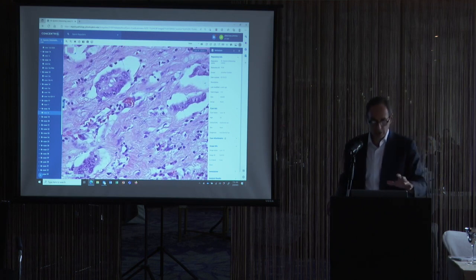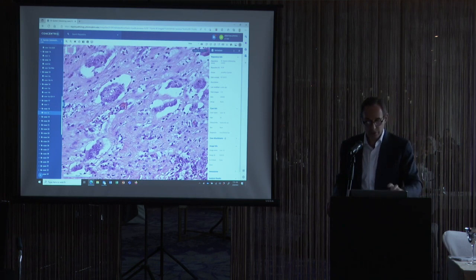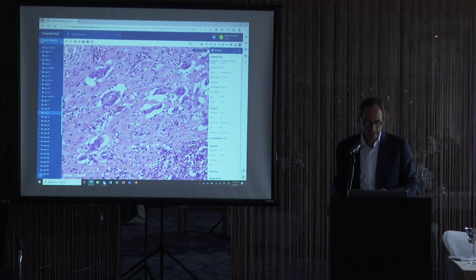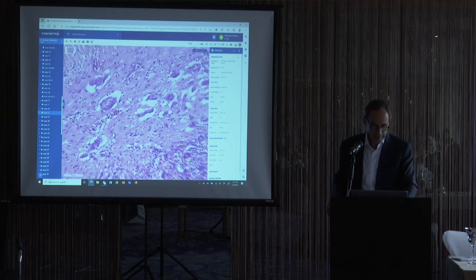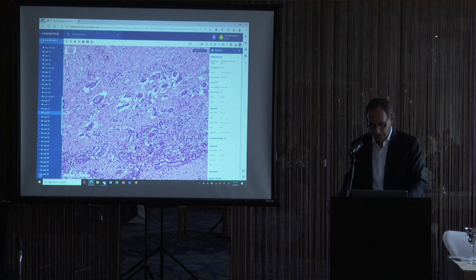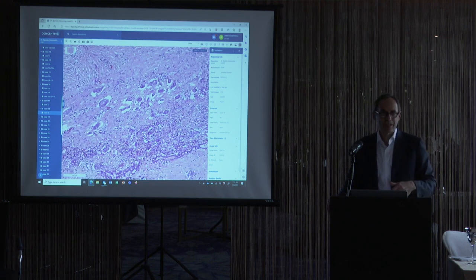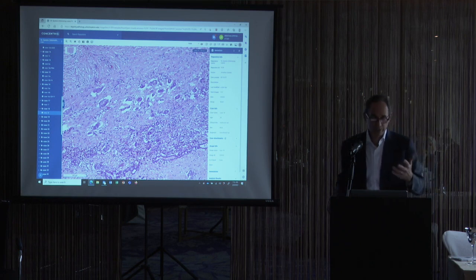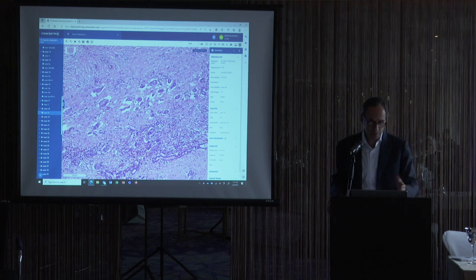There are a couple of immunohistochemical stains. If you're not sure, they can be potentially helpful, but maybe not. MTAP is one, and BAP1 is another, where it's lost in 50% of malignant mesotheliomas. But the problem is the other 50% of malignant mesotheliomas, it's retained. So if it's lost, it's helpful. It tells you it's malignant. If it's retained, it doesn't help you.